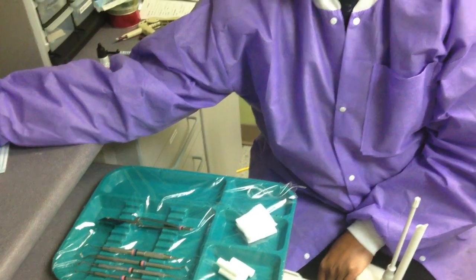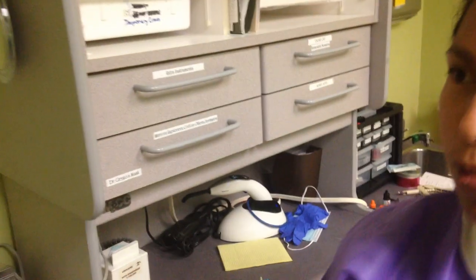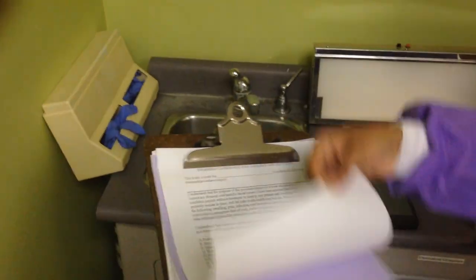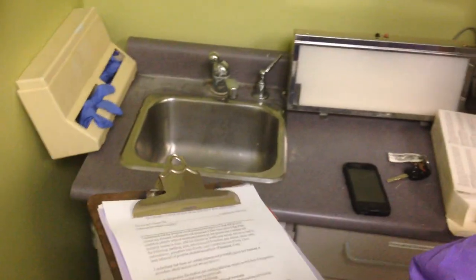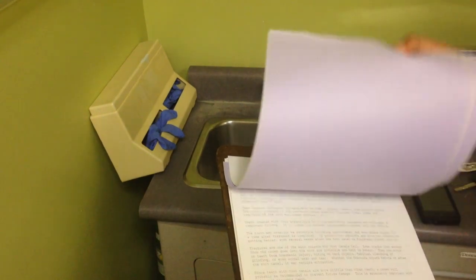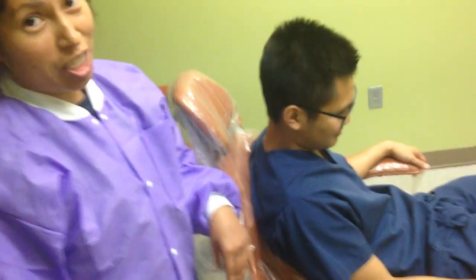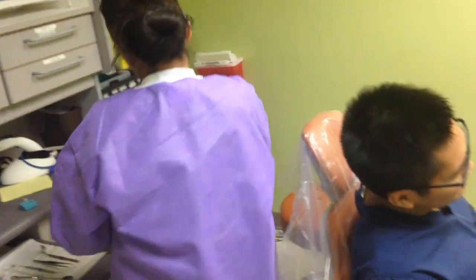When you sit the patient in, you want to get their file, get their x-rays out, and get a consent form for them to fill out — it's signed to give us permission to do the procedure. We have different consent forms; look for the one that says composite. While you're getting that out, you can set up the patient with the blood pressure machine, and while that's going you can finish setting up here.